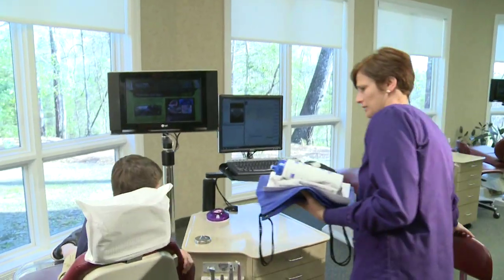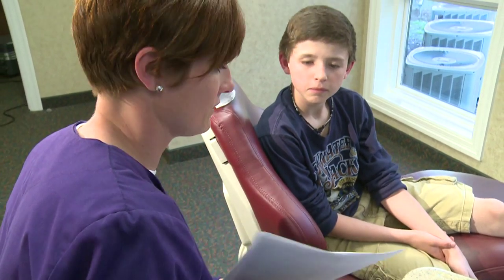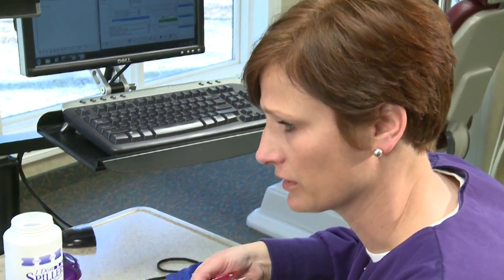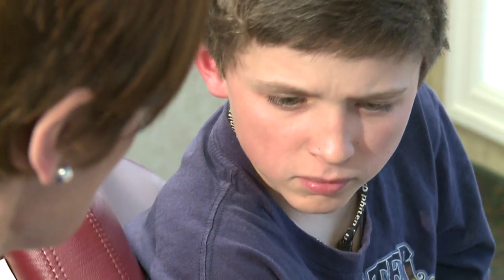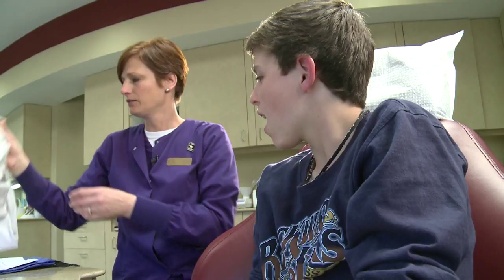After the braces and wires are in place, we spend the next 15 minutes going over the instructions you need to know about how to care for your braces. You want to angle your toothbrush a little bit so that you can get in there. This includes reviewing any foods that should be avoided, oral hygiene instructions, and giving you all the tools you'll need to take care of your new braces.